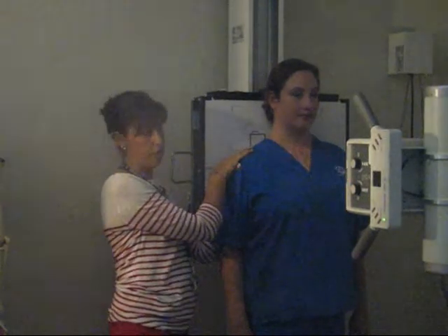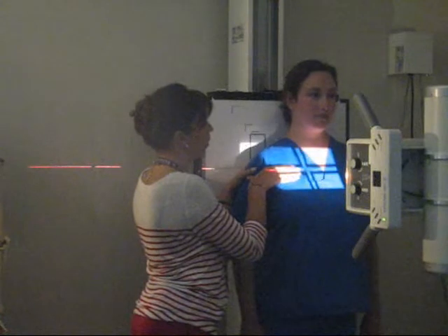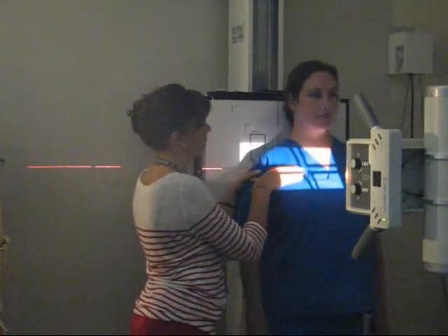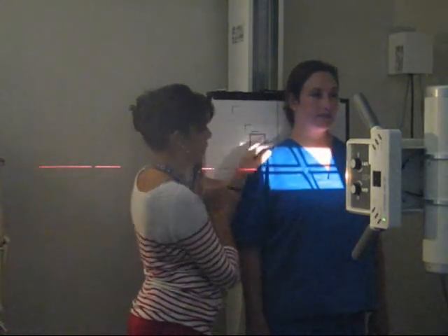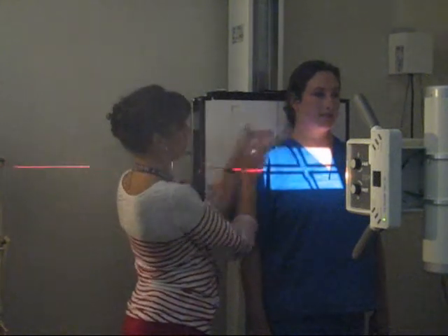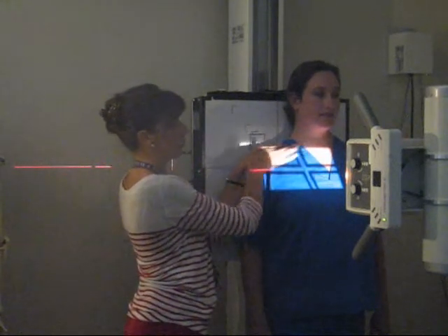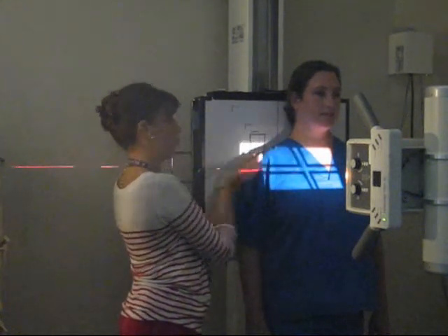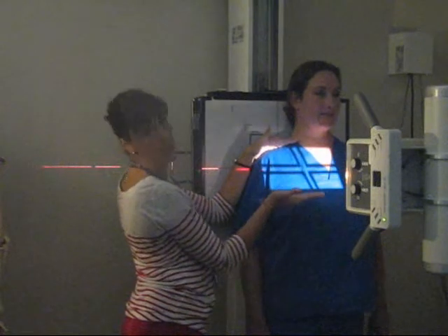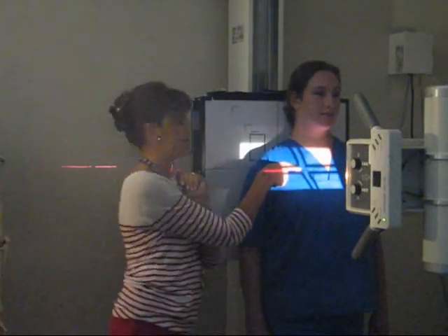In this case, we're doing the right scapula. So you're going to bring your patient, there you go, still straight, okay? Right around the middle, midway through the clavicle, and midway between the clavicle and the breast line, and you'll have your scapula.